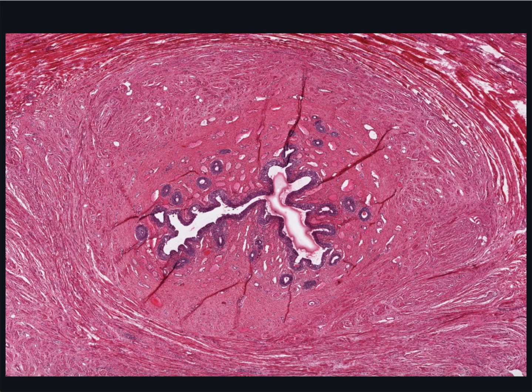Here is a section through the female urethra. It repeats the same 3 layers as you saw in the ureter, but they're thicker. The 2 muscle layers are also somewhat indistinct. Now, the epithelium will vary according to the region from which the section has been taken.